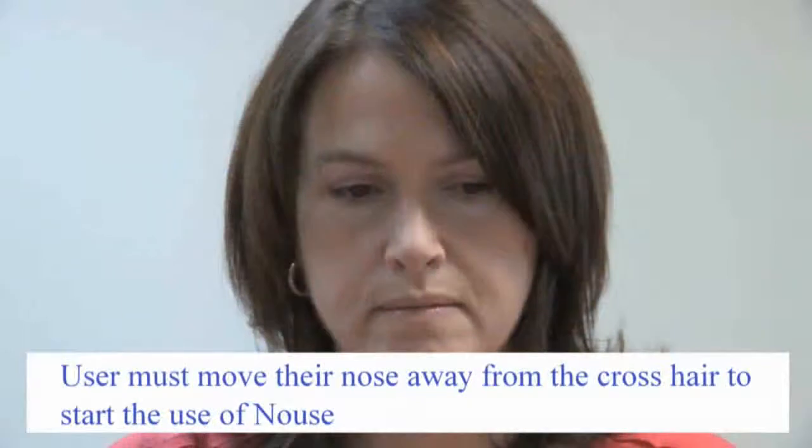Once the countdown is complete, the user must move their nose away from the crosshair to start the use of Nouse. If the user's nose remains still, then the countdown restarts. This calibration process only takes a few seconds.